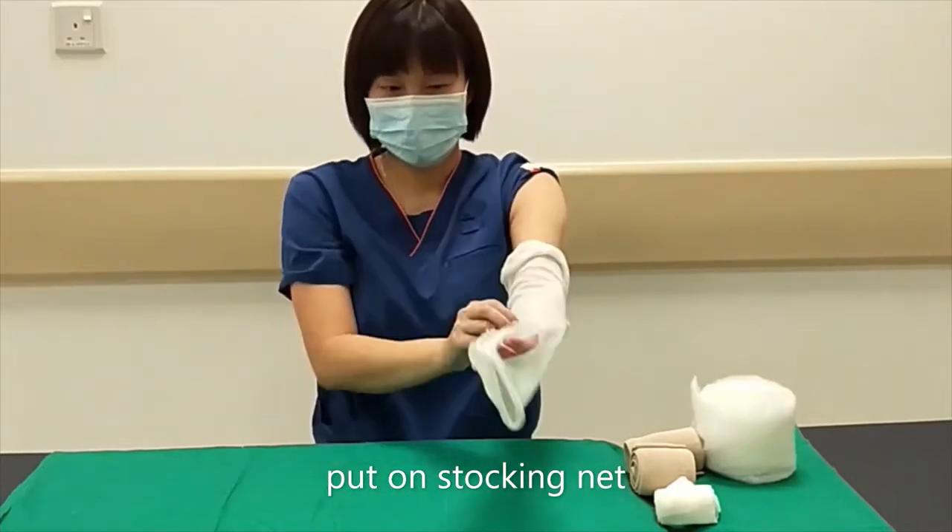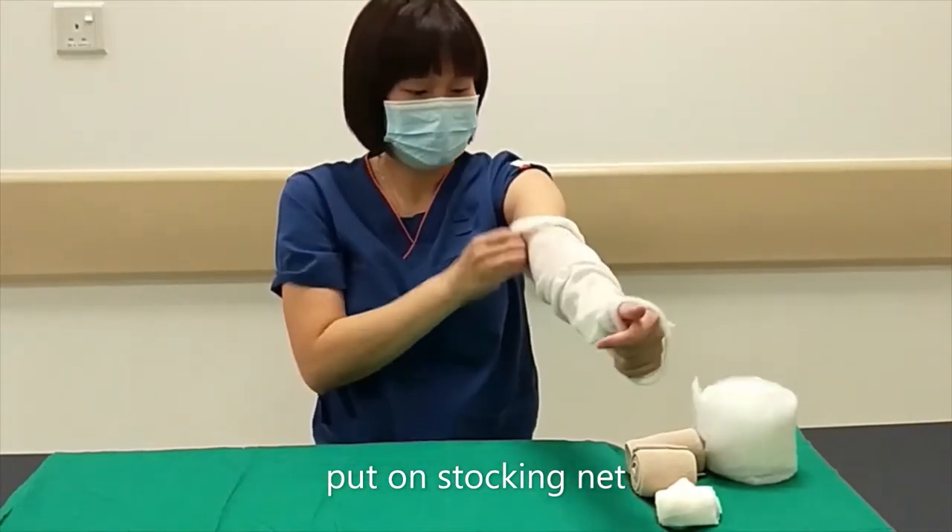Apply a cotton stocking net to protect the skin, rolling it all the way up until the axilla.